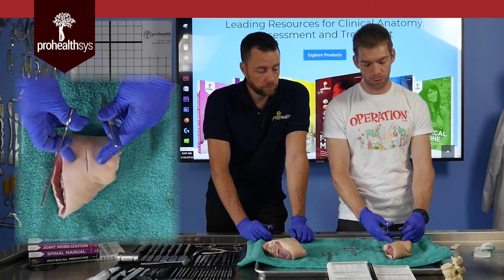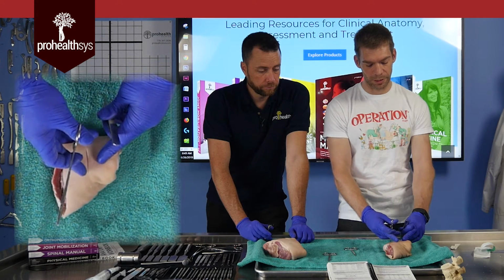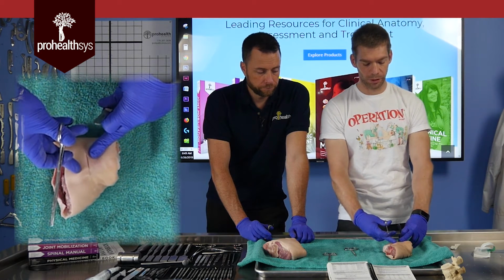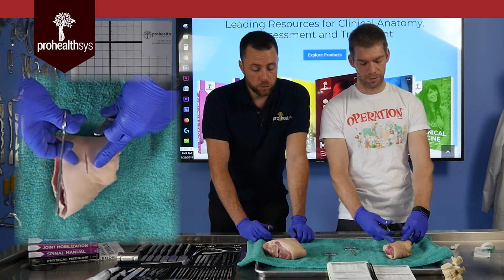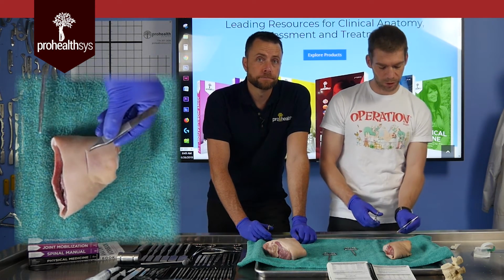So for example, I've got a wound here. If I started suturing up here, and I made little errors as I went down, and the edges of the skin started to be not lined up, see that crinkling? That crinkling equals scar. So again, it's absolutely fundamental that you have perfect alignment as much as possible from all the fibers across. It ends up with a really nice result.